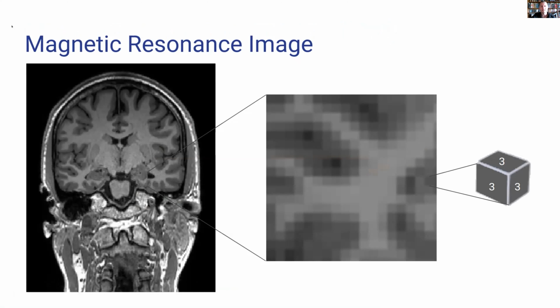So this image that we can see on our left is actually, as you might guess, an MRI image. It's taken an image of the head, and it's basically a slice which exists sort of between the two ears, like the front of the face has been sort of sliced off.